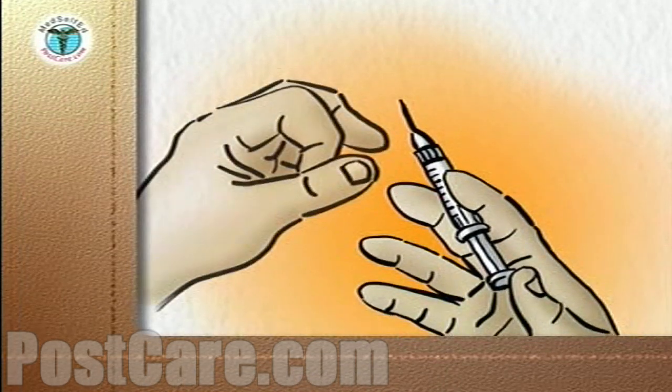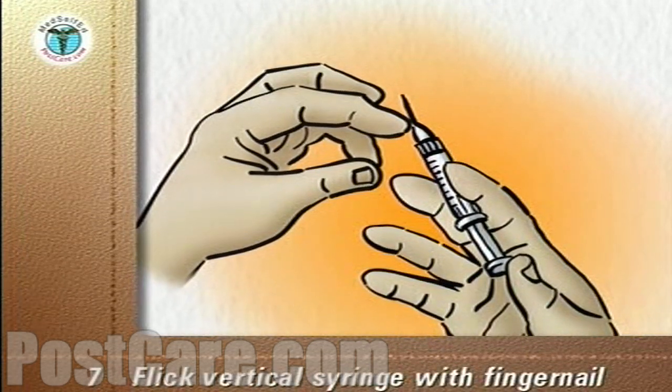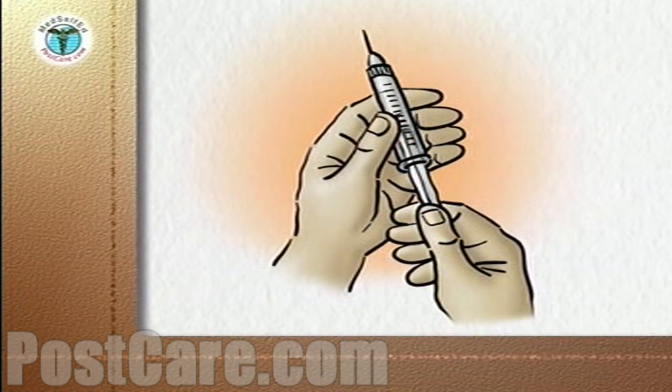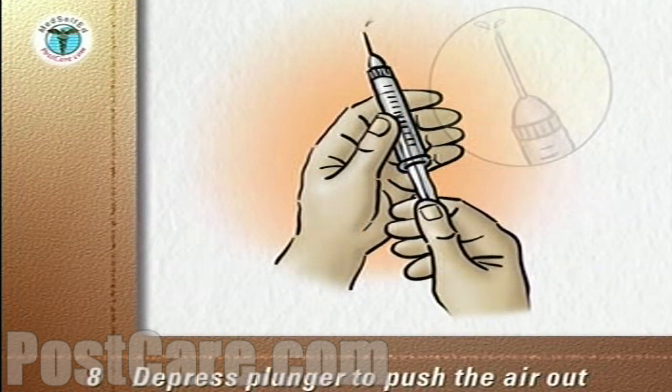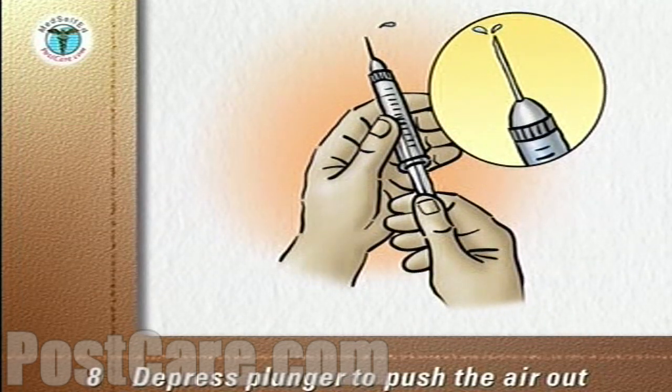Hold the syringe vertically and flick the barrel with a fingernail to make any air bubbles float to the top under the needle. Carefully depress the plunger to push out the air until the first drop of medication comes out of the bevel of the needle.